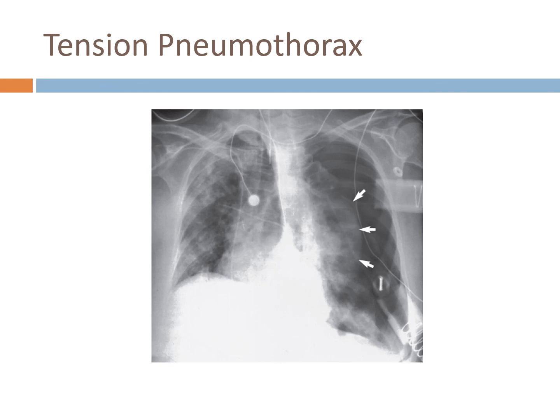Tension pneumo. So actually both of these images are from your textbook. So here is a tension pneumothorax, sometimes caused from positive pressure ventilation.